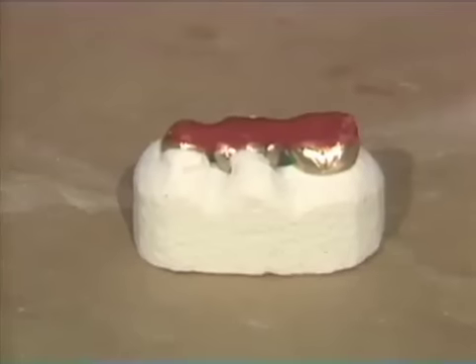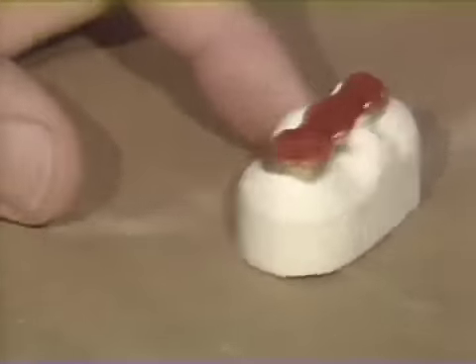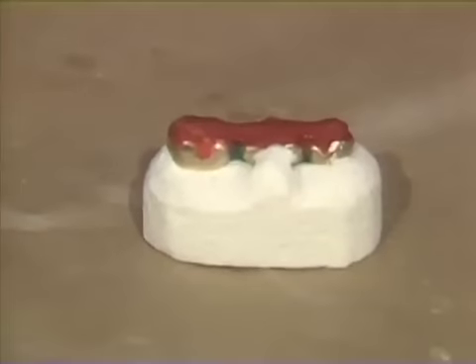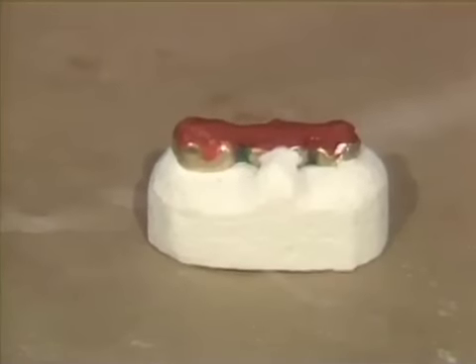Now we can just take this and scrub it under running water to make sure that we have no small pieces of investment trying to go into those embrasure areas that would interfere with our soldering. The soldering investment has been scrubbed under running water, all the loose investment is off, and it's very clean. Now we just want to let it set for about 20 minutes to half an hour from the start of the mix, and we're ready to start soldering.